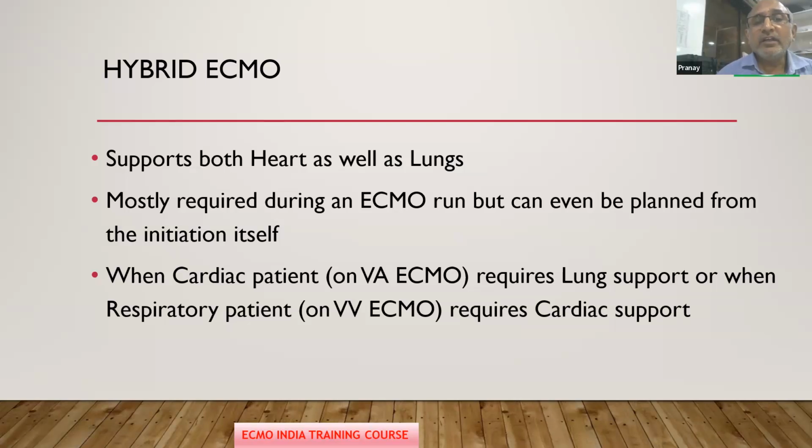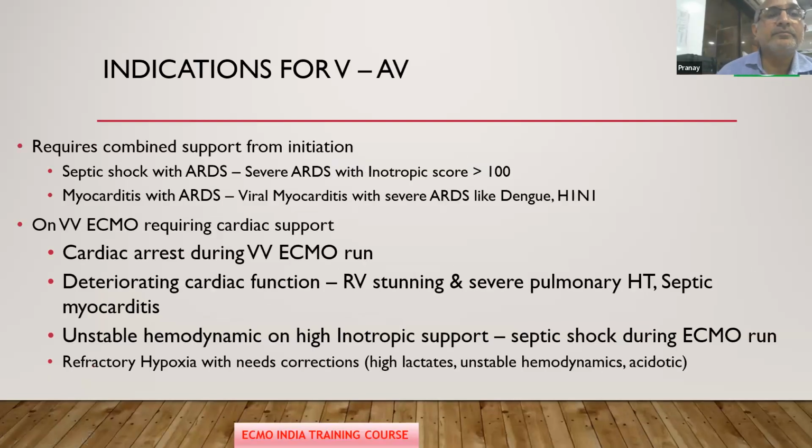Okay. So when the cardiac patient requires lung support or when the respiratory patient requires cardiac support, you have to go for a hybrid ECMO. So what are the indications when we require hybrid ECMO? It is required from the initiation.